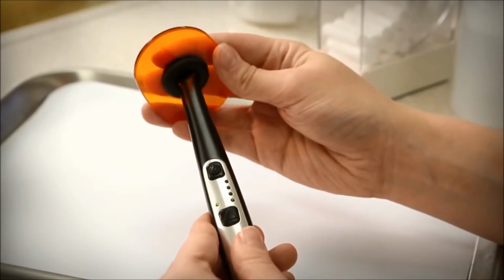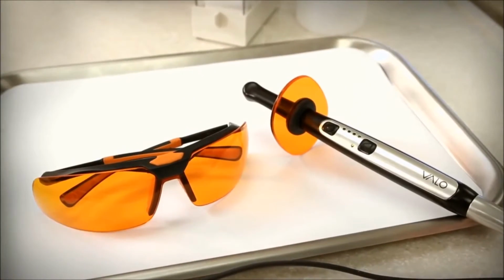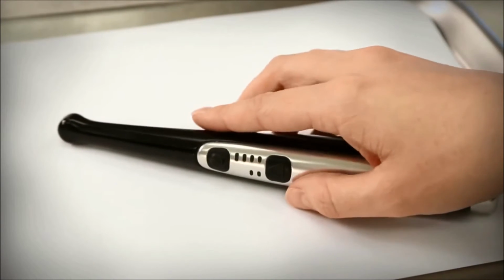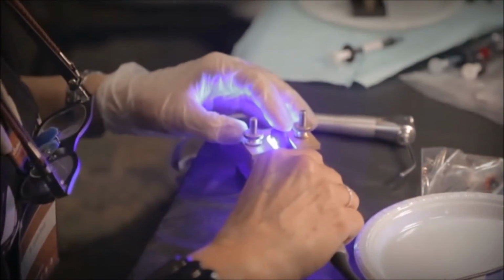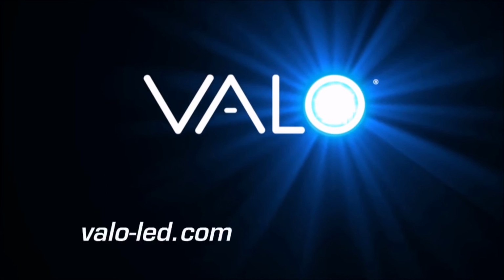Before you begin, please find the orange safety glasses or light shield that have been provided. When light polymerizing any dental material, we always recommend the use of appropriate eye protection. Please note, the VALO is designed to go to sleep when not in use. When you are ready to use the VALO again, it will remain with the same settings as when it was last used. Enjoy the course, and please feel free to speak to a representative if you have any questions about your light.